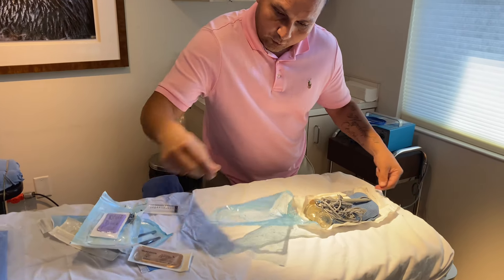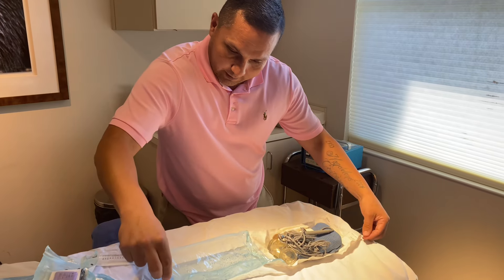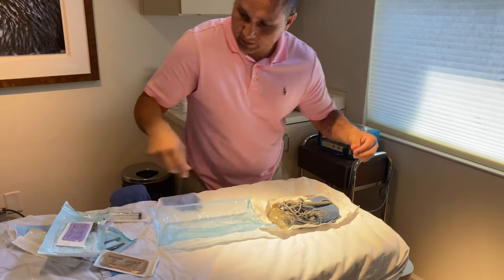I'm going to contaminate it in the corners because nothing will touch the corners. Everything will be inside this middle sterile field.